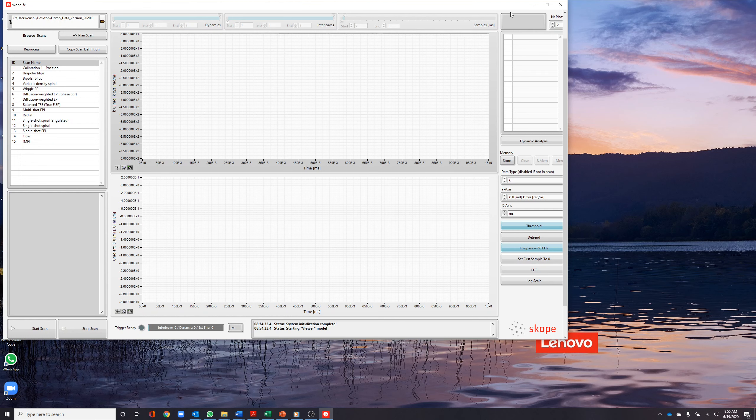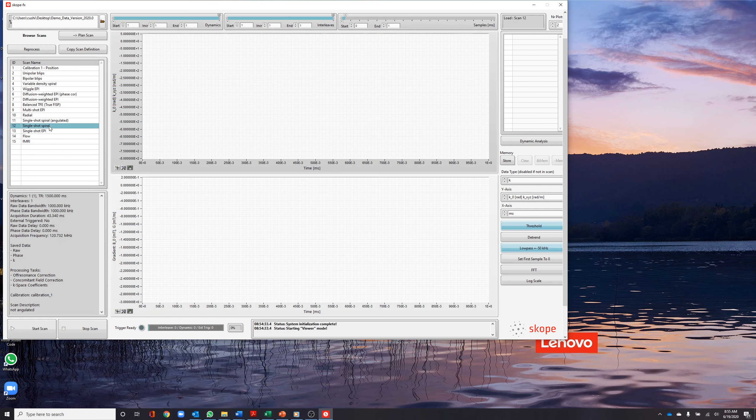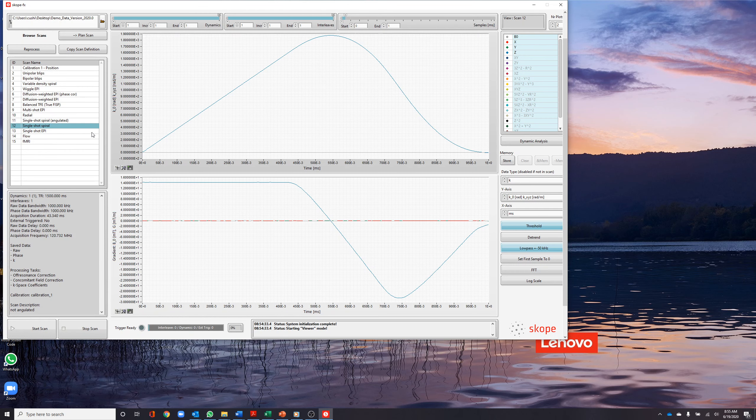For this demonstration, we select a single-shot spiral dataset. The acquisition parameters are displayed below the selection panel.